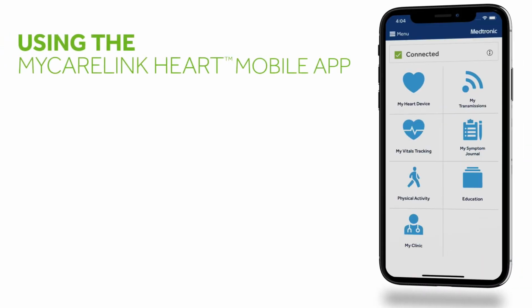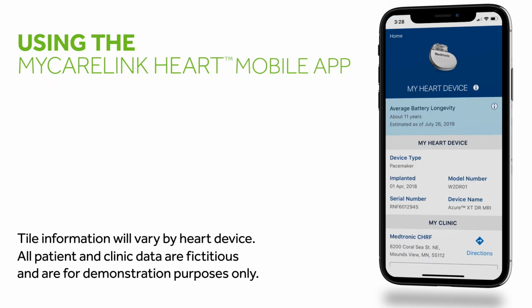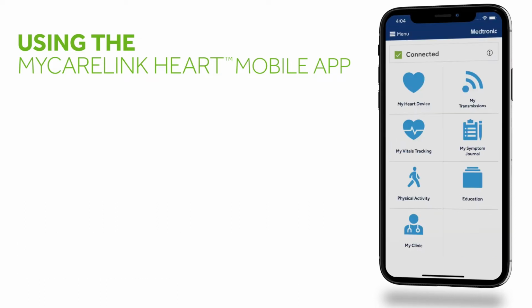When you open MyCareLink Heart, you will see this home screen. The My Heart Device tile lets you see information about your heart device, like serial number and device name, as well as information about your clinic, so you are comfortable answering questions when asked.